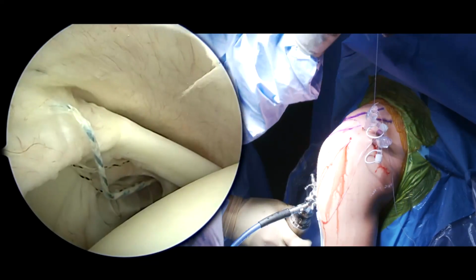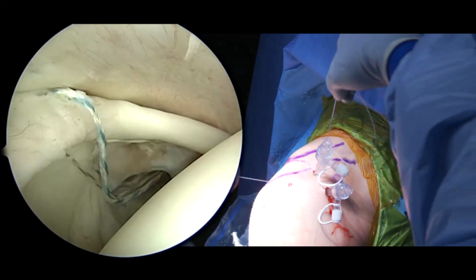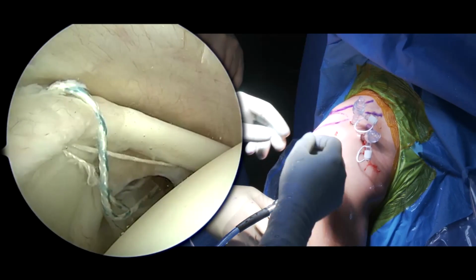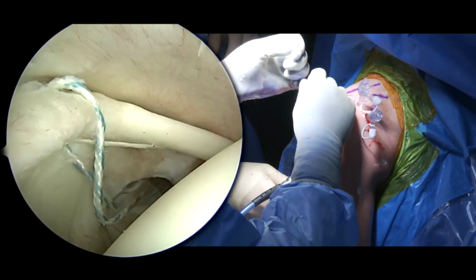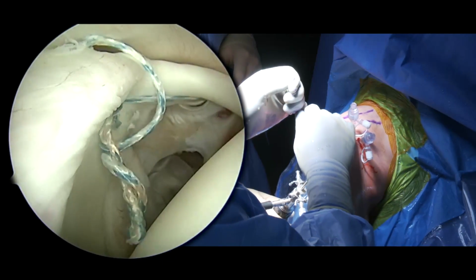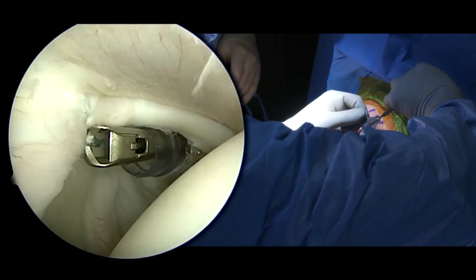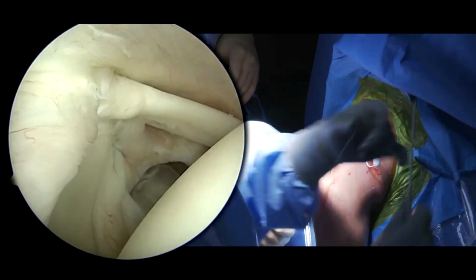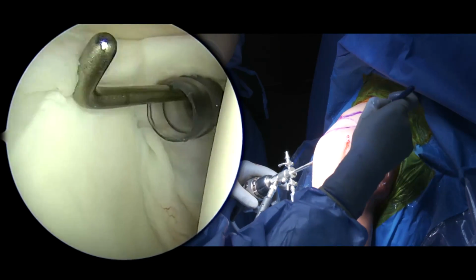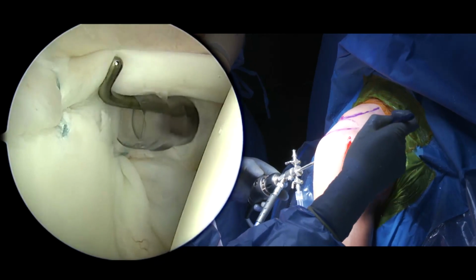The working suture is once again placed into the knotless shuttling suture, and the posterior labral complex can be manually tightened and fixated to the superior glenoid. The working suture is then cut flush with the face of the glenoid, and with the use of an arthroscopic probe, the biceps root is reprobed to ensure that the SLAP tear has been fully stabilized.